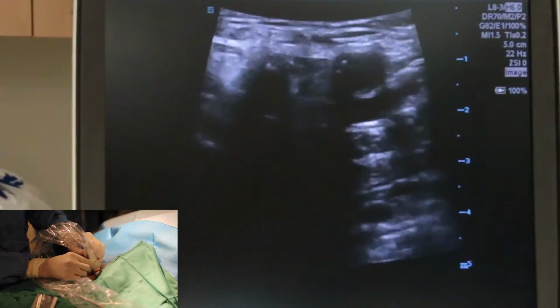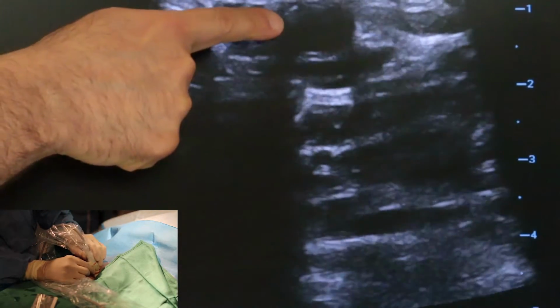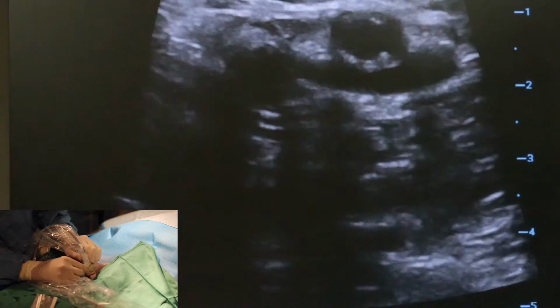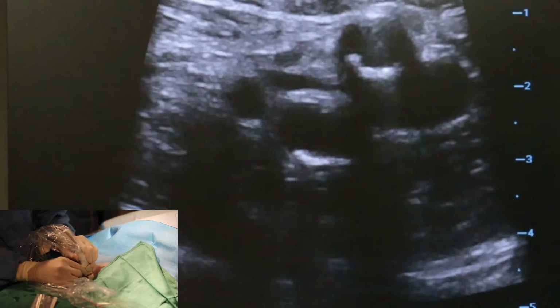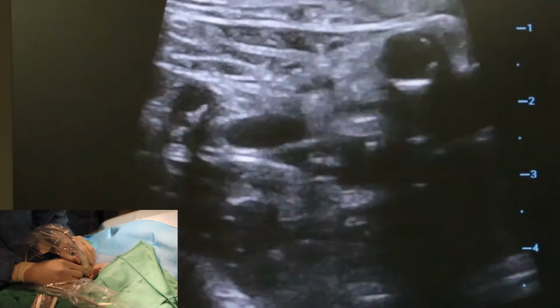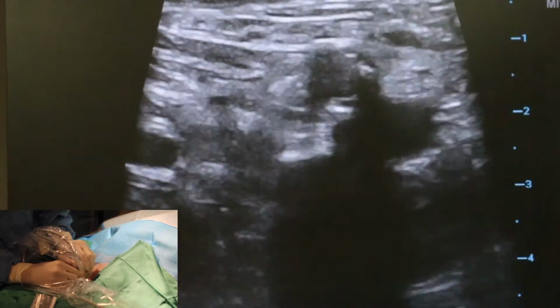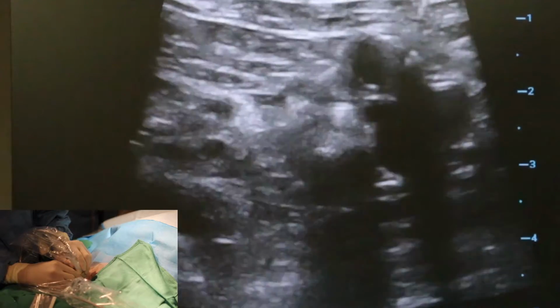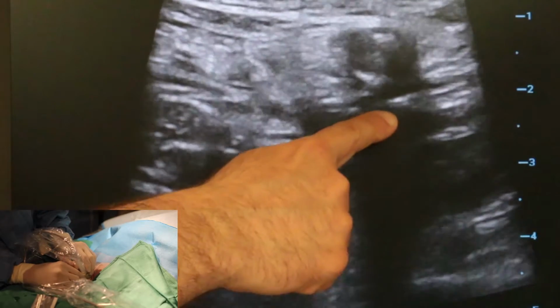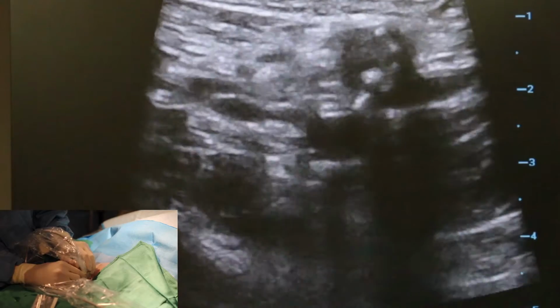What you see here is dead center we have the artery, and right below that is the vein. If I scan down, I'm looking to see if I can find a bifurcation. It must be a low bifurcation because I don't see one. I just see the vein, which you can tell because I can collapse it by putting external pressure. If I push pressure down, the vein collapses.